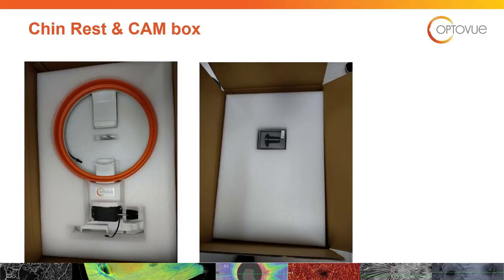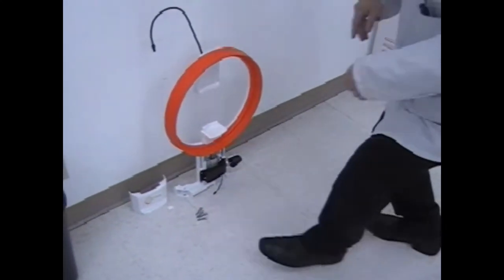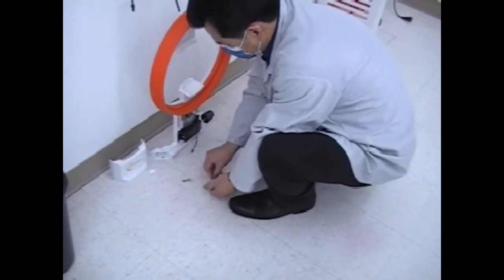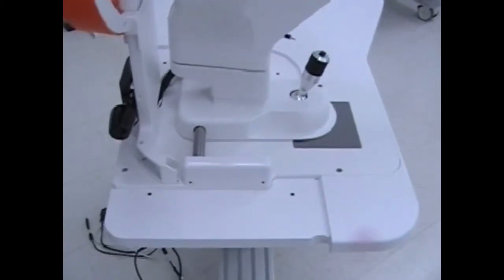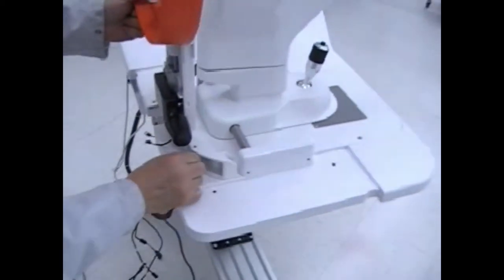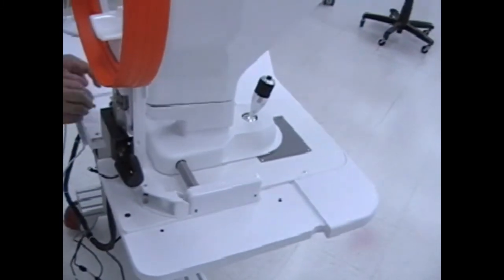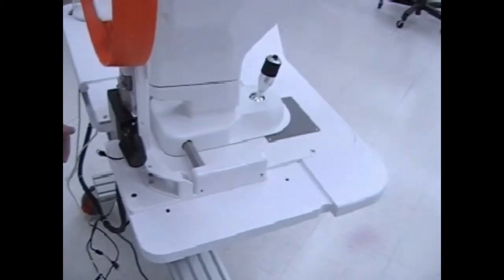Unbox the chin rest. There should be four bolts to attach it to the table, and there should also be the cam module. Unbox the cable. Make sure the cable from the scanner head is under the chin rest bracket, and remember to connect and tape down the power connection for the external fixation.